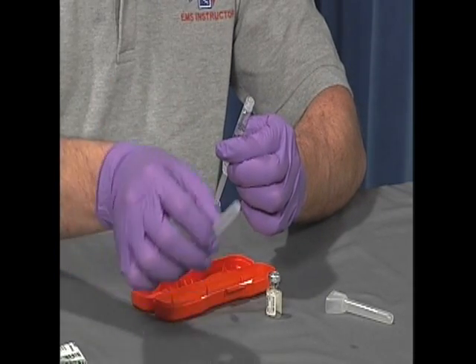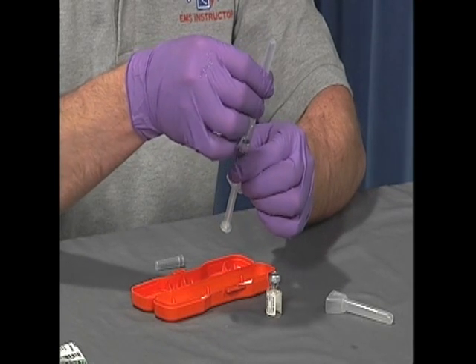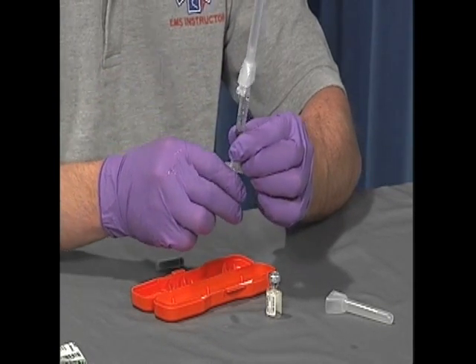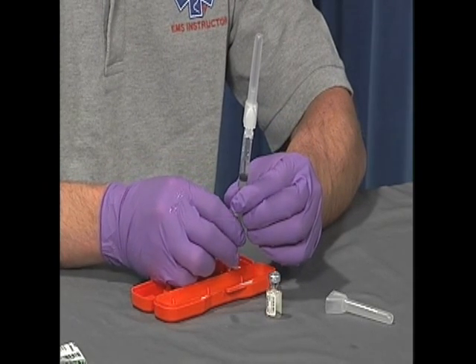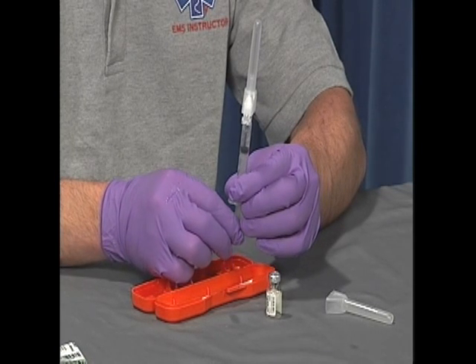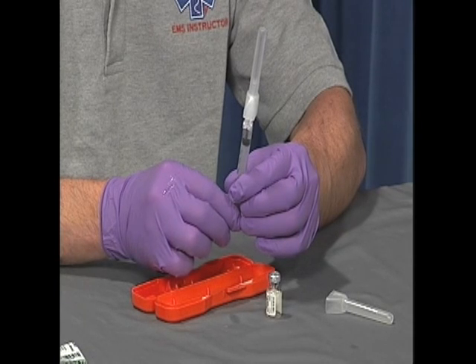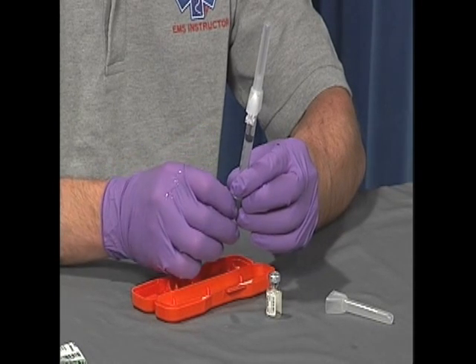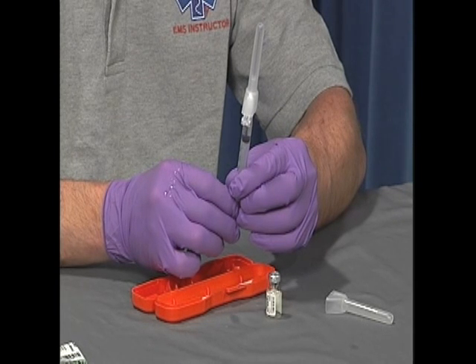Depending on the route of administration, select the appropriate size safety engineered needle. With the needle pointed upward, gently tap the syringe to move any air bubbles to the top. Gently depress the plunger of the syringe until air is expelled and only the desired amount of medication remains in the syringe. The medication is now ready for administration.